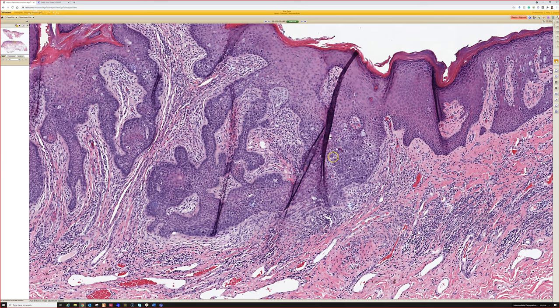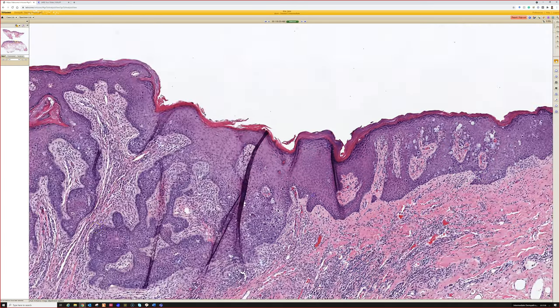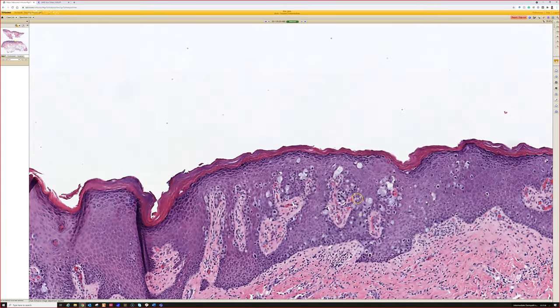And we can sometimes see that in association with other tumors. I wonder if that's what's going on here, like a strange basaloid epidermal induction, like hair follicle type epidermal changes related to the tumor. I don't think I've ever seen that before in Paget's. It's kind of an interesting case.